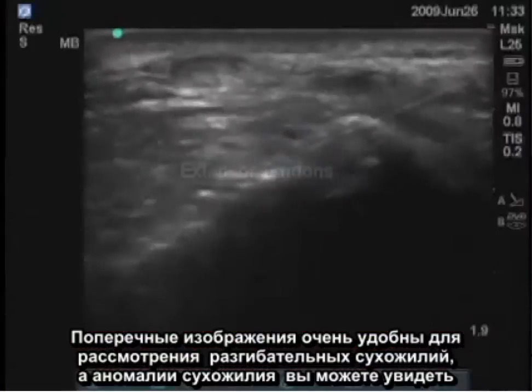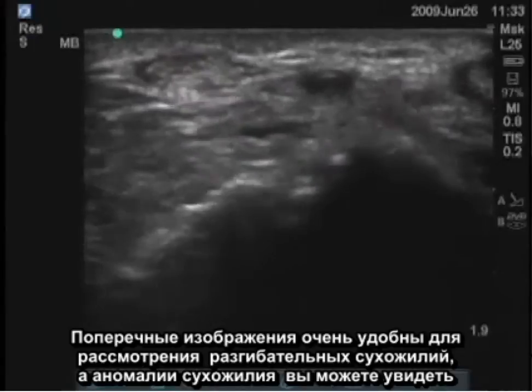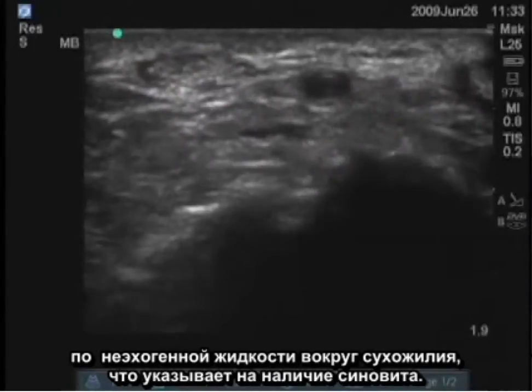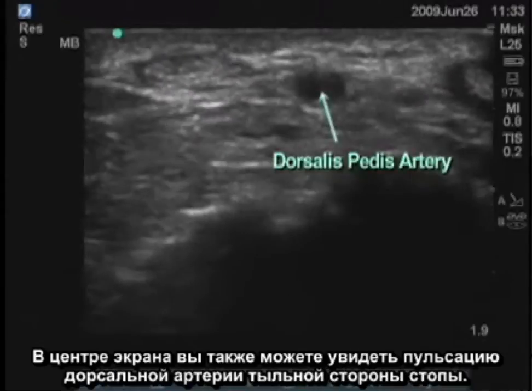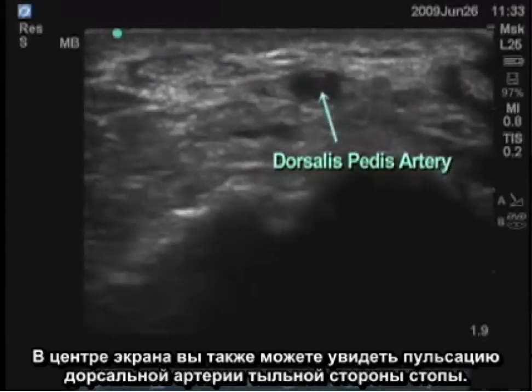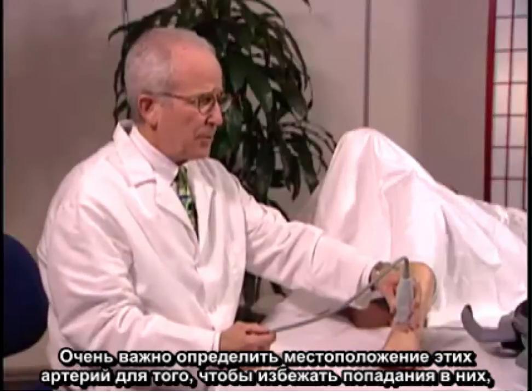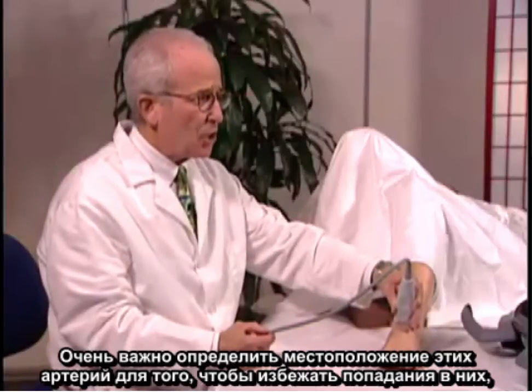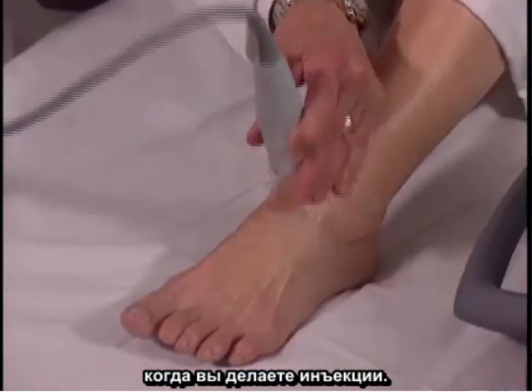Transverse images are very good for looking at extensor tendons and for tendon abnormalities. You might see anechoic fluid around the tendon or synovitis. You can also see in the middle of the screen the dorsalis pedis artery pulsating. It's very important to identify the position of the arteries so that when you do injections, you'll be able to avoid them.